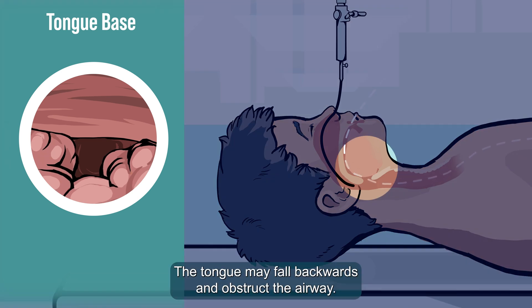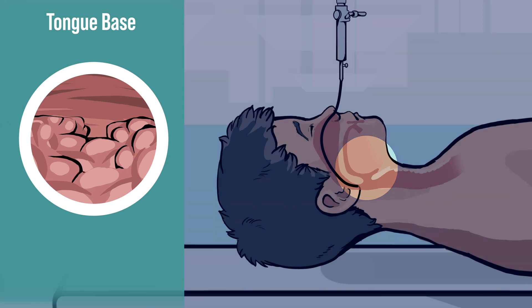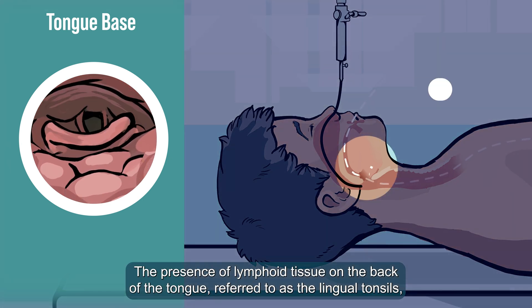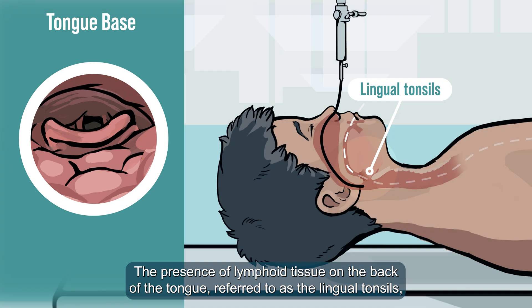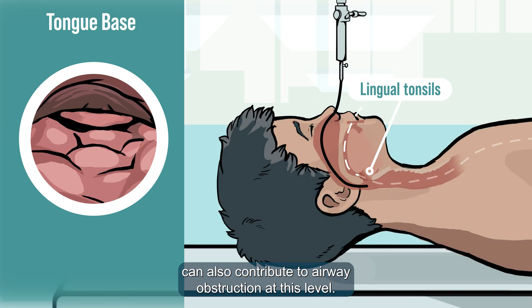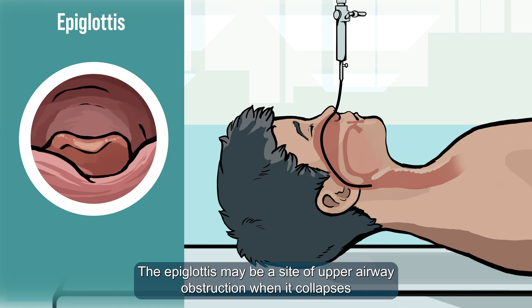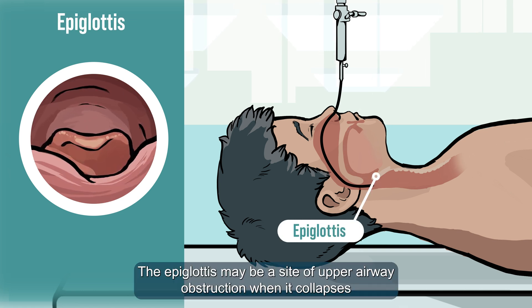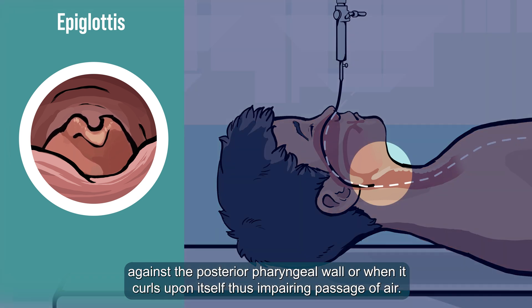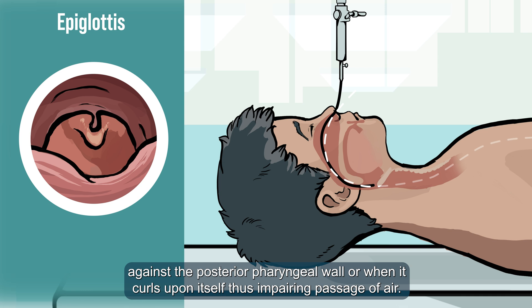The tongue may fall backwards and obstruct the airway. The presence of lymphoid tissue on the back of the tongue, referred to as the lingual tonsils, can also contribute to airway obstruction at this level. The epiglottis may be a site of upper airway obstruction when it collapses against the posterior pharyngeal wall or when it curls upon itself, thus impairing passage of air.